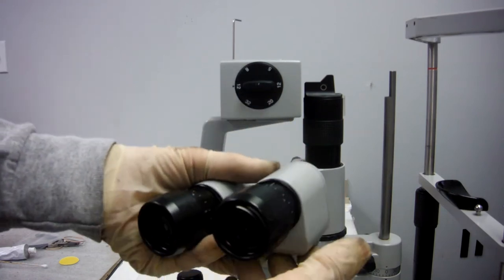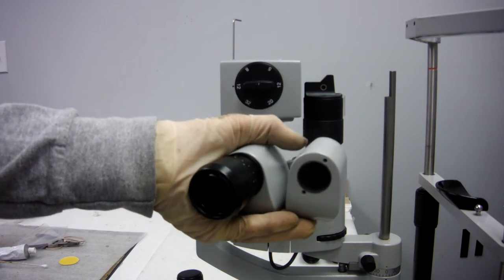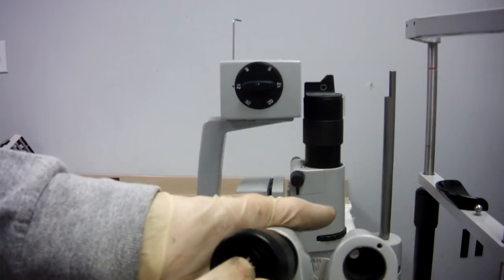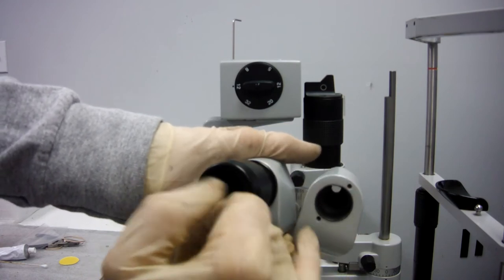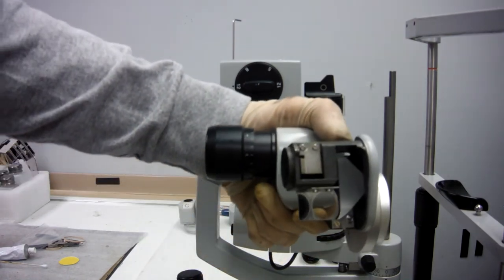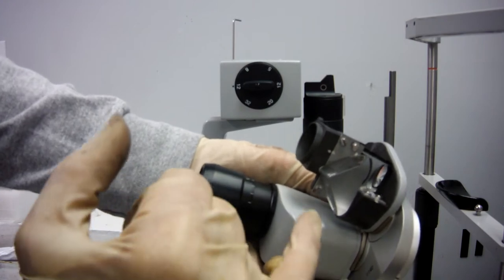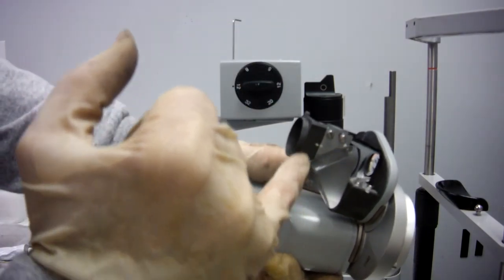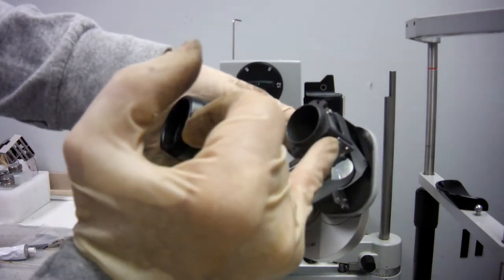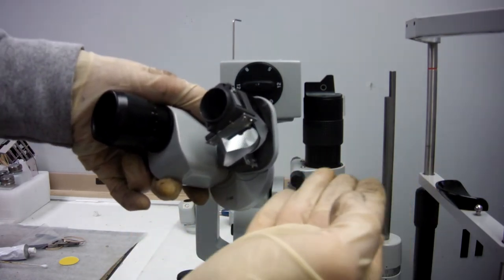But if you needed to go sideways, you'd have to go inside the head. Take out your eyepiece. There's two screws right here. Take the cover off. And you have your prism assembly. And underneath the prism assembly, you have three screws. You loosen those three screws. You can move your prism assembly left or right, and that will help you to line up left or right.